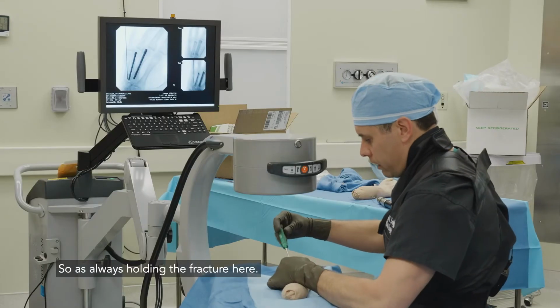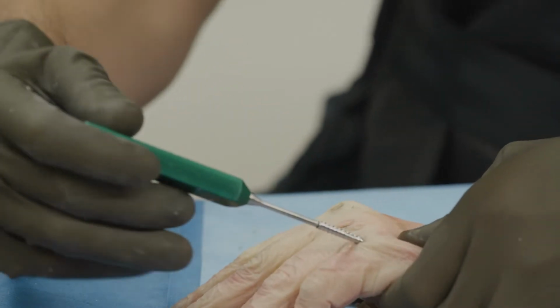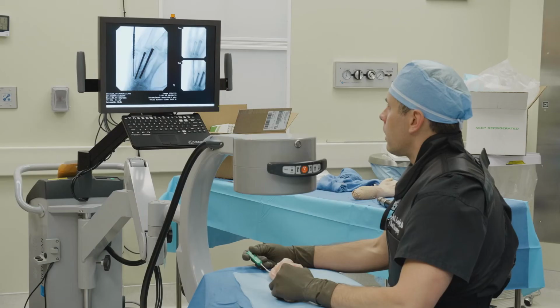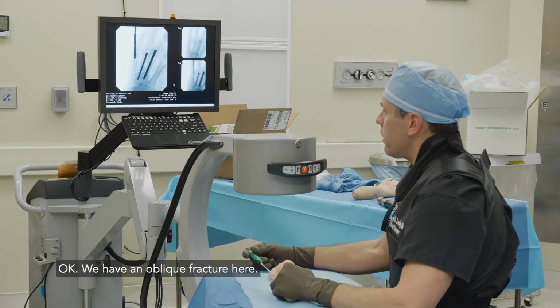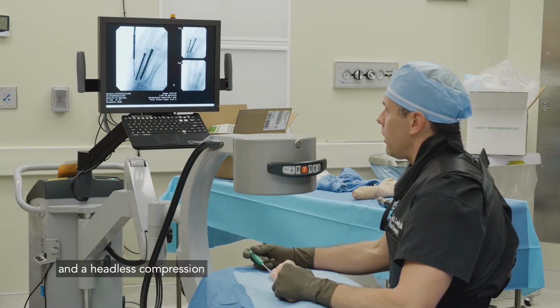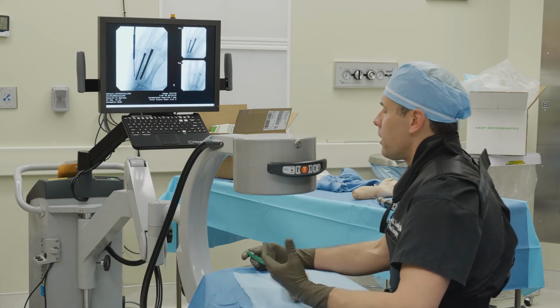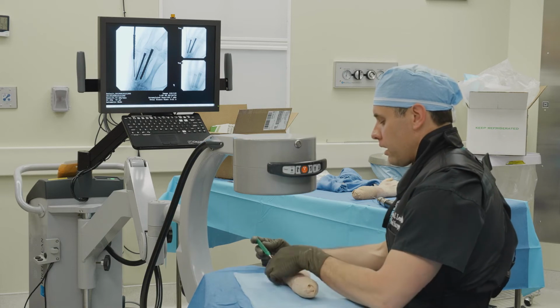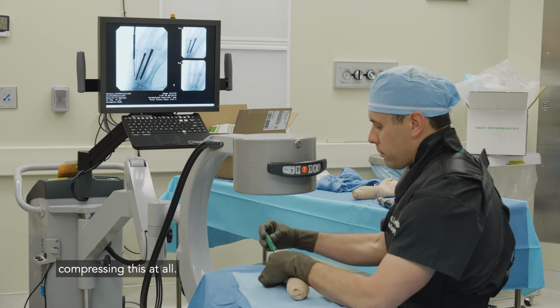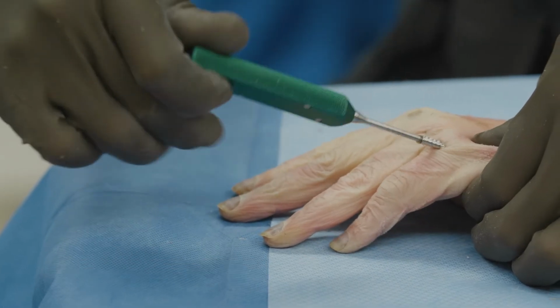So as always, holding the fracture here. Okay, we have an oblique fracture here, and a headless compression screw in this type of fracture pattern always sets patients up for potential shortening of the metacarpal and frustration on the part of the surgeon. So I don't really worry about compressing this at all. This is a non-compressive screw, so I just advance right across there.